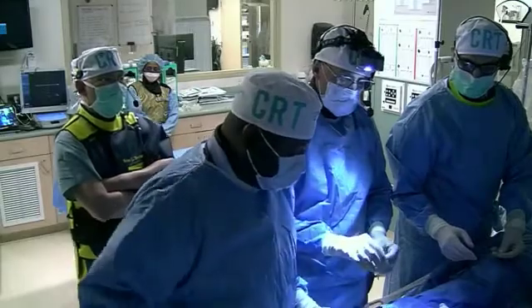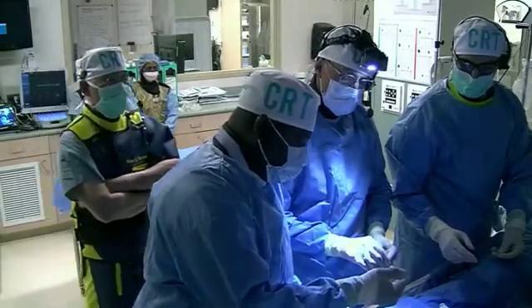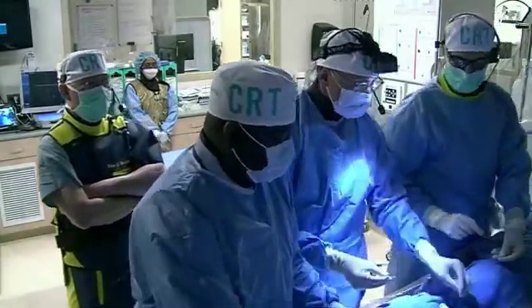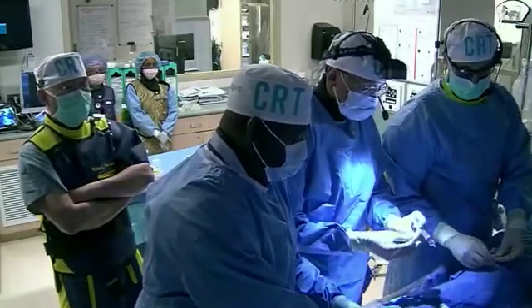I do believe that you need something more than just balloon to get this area, which looks narrow and calcified beyond just balloon. Can you flip it twice, Justin? Flip it to contrast twice, please.